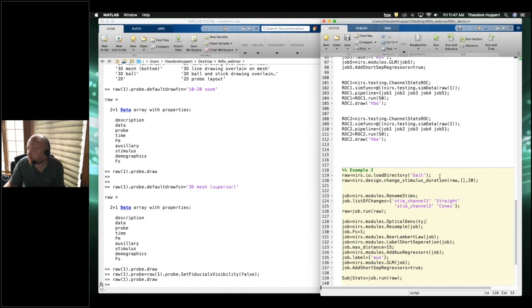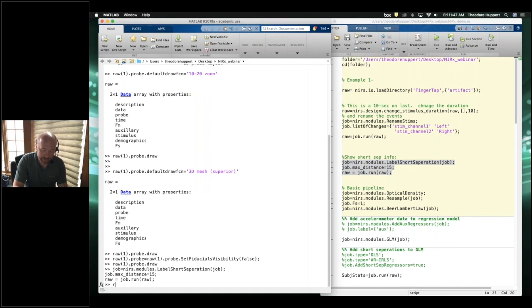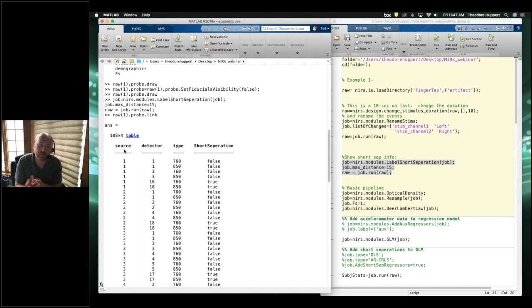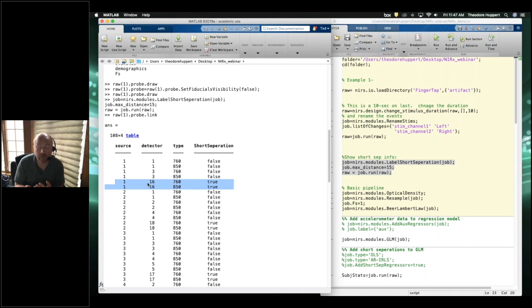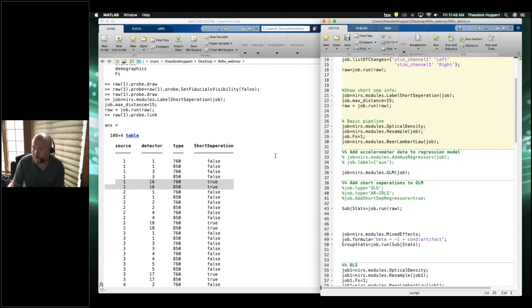In the toolbox, if we label which channels are short separations we can use them within our GLM model. We run a module called label_short_separations. Looking at the probe link variable — which shows all 108 channels with source, detector, wavelength — the last column indicates whether a channel was a short separation. Source one, detector 16 was identified as a short separation channel.